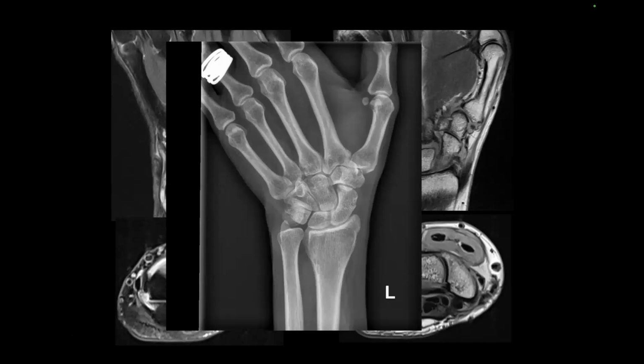Interestingly, if you look at her radiograph, she has almost no disease. She's got no erosions. Her joint alignment looks almost completely normal. So the diagnosis in this case was purely based upon the MR. She went on to have clinical testing, was found to be rheumatoid factor positive, and has since been started on treatment. So the imaging in this case is identifying early subclinical disease before it's even present on radiograph.